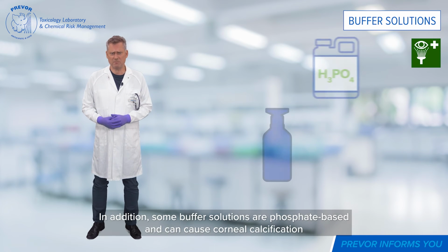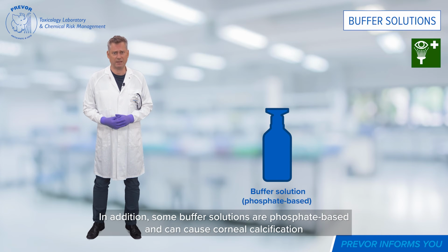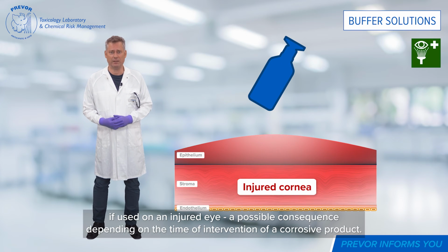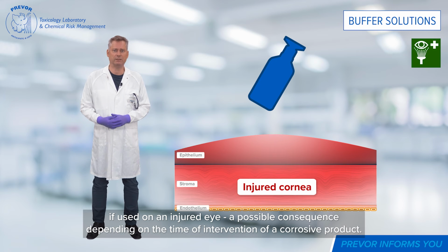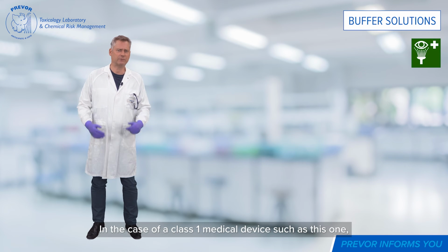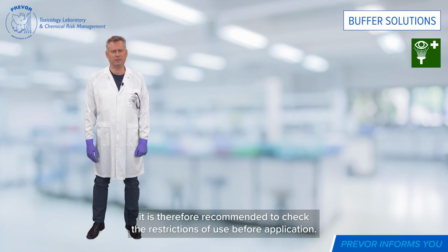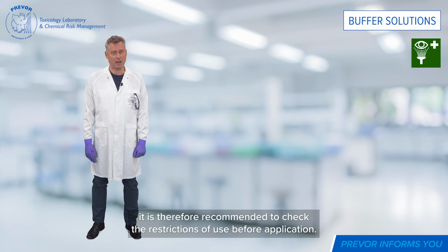In addition, some buffer solutions are phosphate-based and can cause corneal calcification if used on an injured eye, a possible consequence depending on the time of intervention on a corrosive product. In the case of a Class 1 medical device such as this one, it is therefore recommended to check the restrictions of use before application. This restriction reduces the field of use and makes buffer solutions difficult to use.